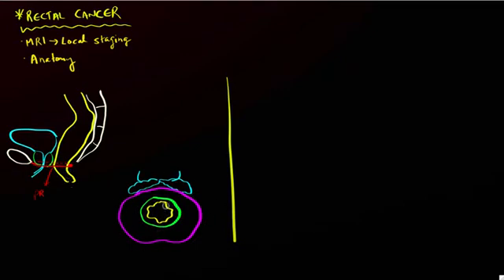This is an axial image through a portion of the rectum. There are different parts of the rectum that we can see here. The most inner layer is the mucosa, so that's marked in yellow. The black layer in between the mucosa and the green line is the submucosal layer. And finally, the outer green layer here is going to be the muscularis propria. So I'm just going to write MP for muscularis propria.